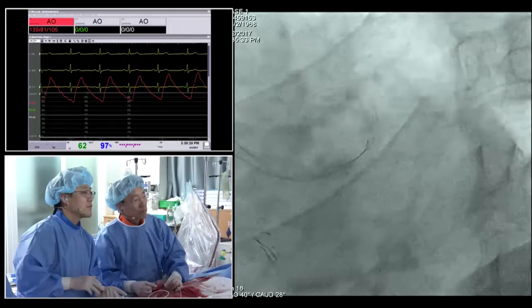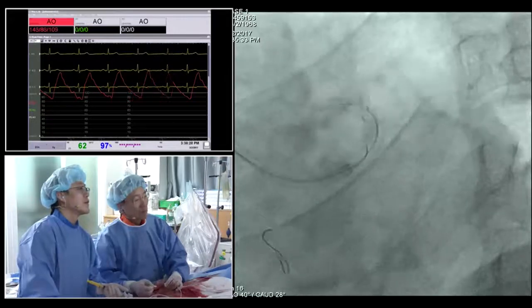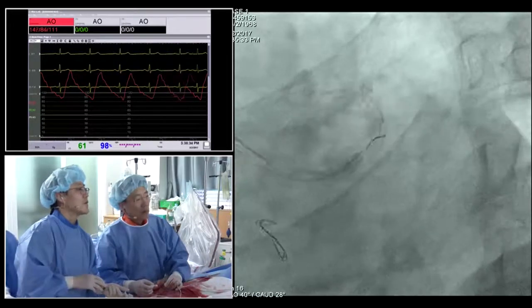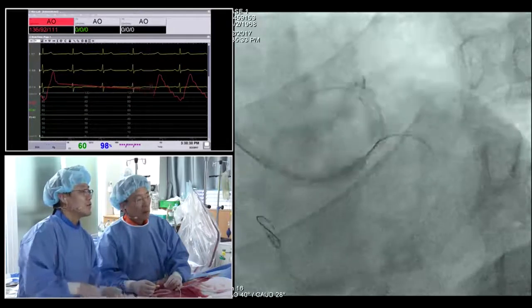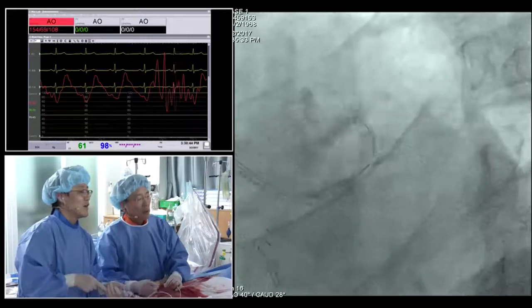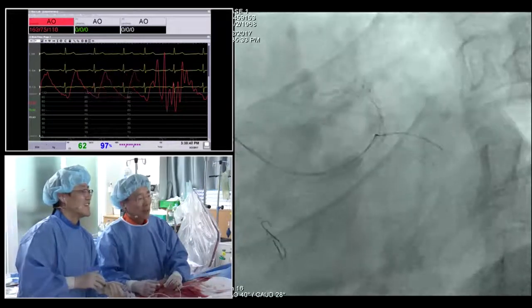So some consolation. Oh, really? The angle is very stiff. Very stiff. Okay, good. Okay, great. Wow. All right. Did you see that angle? Yeah, by chance, and I don't believe it's a kind of technique. Wow. The wire just passed. I didn't do anything.